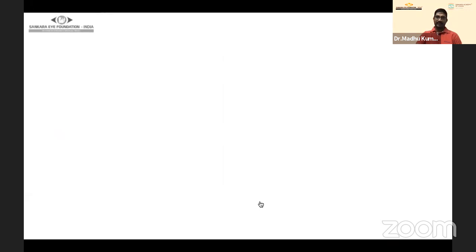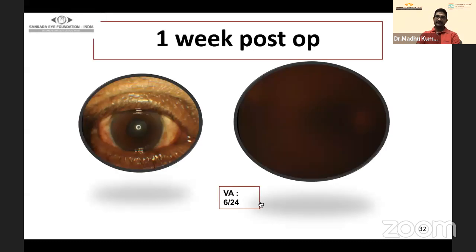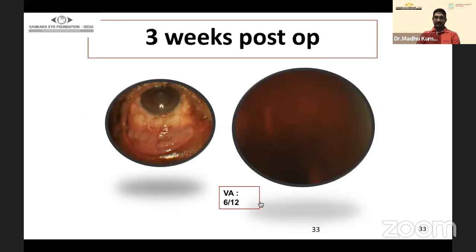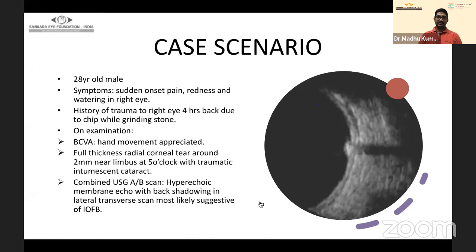All vitreous was removed, the retinal tear was delineated and laser applied, and the entry and exit wounds were identified. Fortunately the patient did not have retinal detachment. Because the eye was formed and the entry wound was self-sealed, we could manage it in a single step. At one week and three weeks post-op the patient retained good visual acuity.